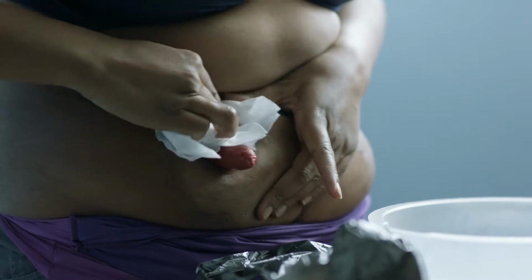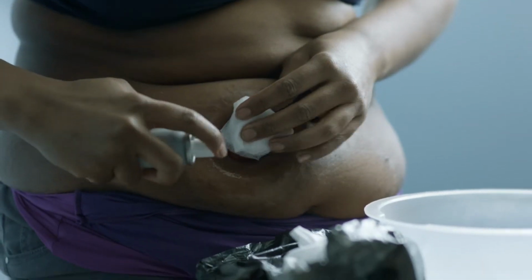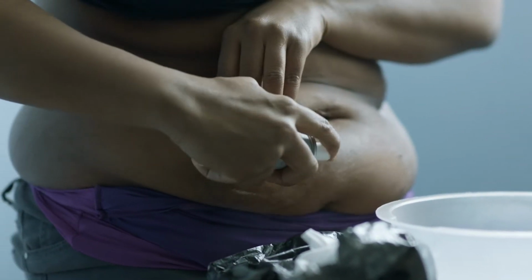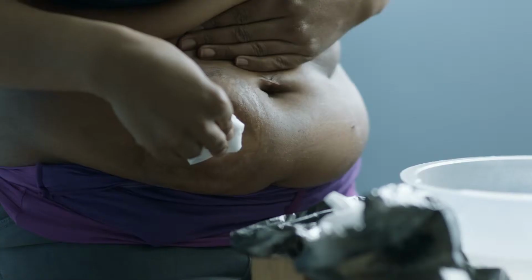I then dry the area, make sure it's very dry, and I get a piece of tissue and I wrap it around my stoma and spray on the barrier protection spray. I like to use that because I just find it helps keep my skin clean and clear. Because I have an ileostomy, the waste can be quite acidic and it can burn, and so that's why I like to use a barrier spray.